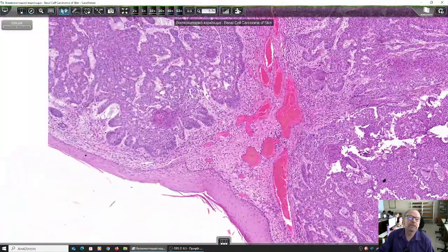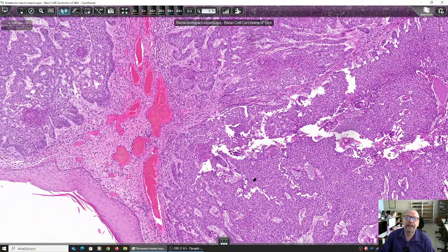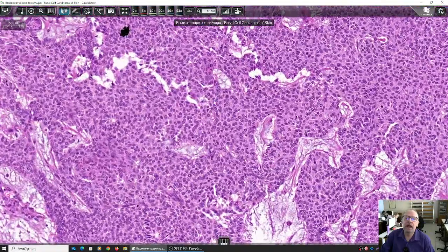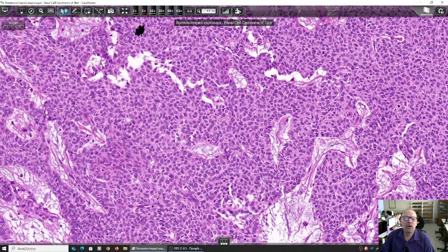So, this is the normal epidermis, and this lesion is clearly developing in the dermis, and I want you to tell me which cells of the normal layers of the epidermis these cells resemble. Do they have much cytoplasm? That means, are they pink? Do they stain with eosin, the pink staining of the cytoplasm? No, they appear purple.